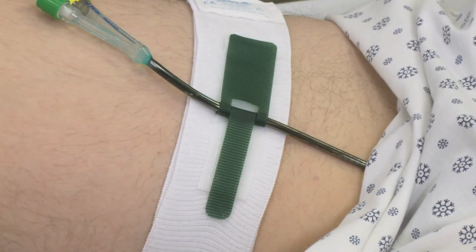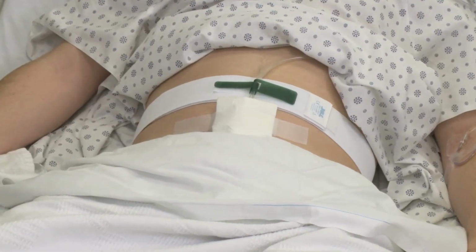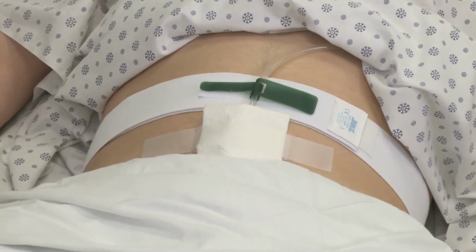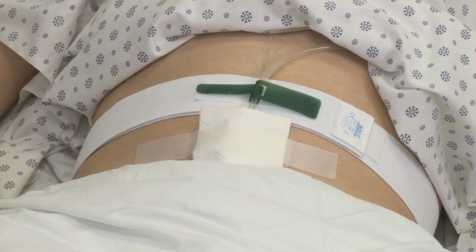When traction is required, as is frequently needed following a transurethral resection of the prostate, stretch the catheter and secure it in place. An abdominal urinary catheter holder, the Dale 330 waistband, is also available for patients who have suprapubic catheters, or to secure the catheter in an upwards position to prevent penile scrotal stricture.